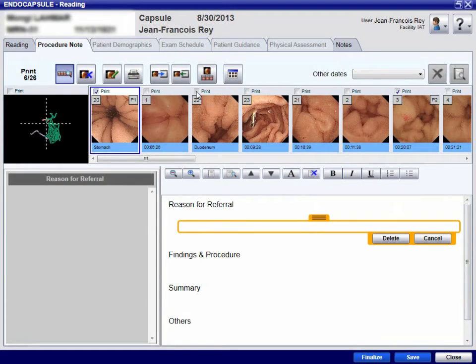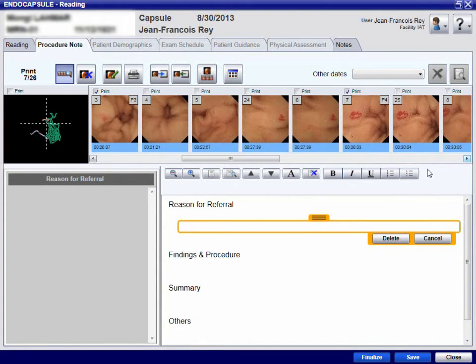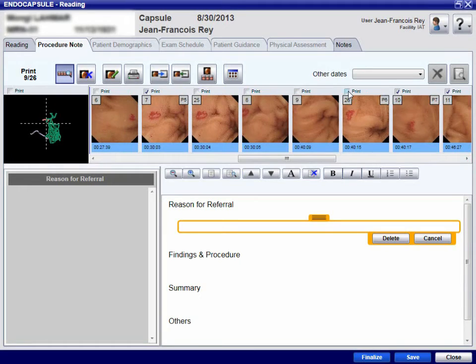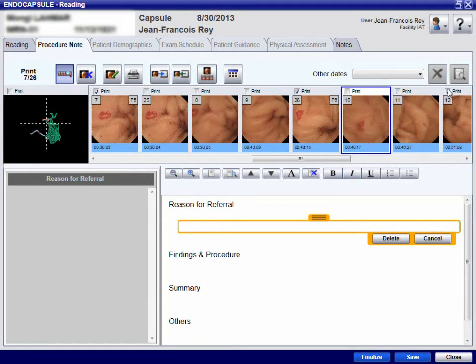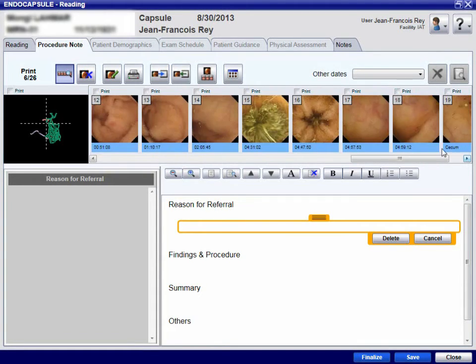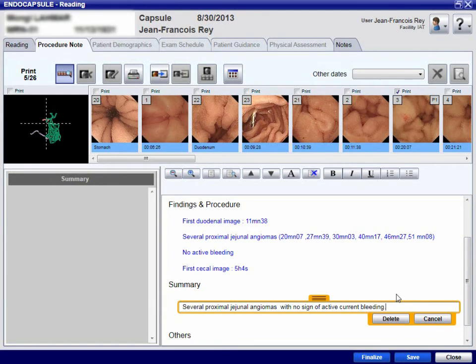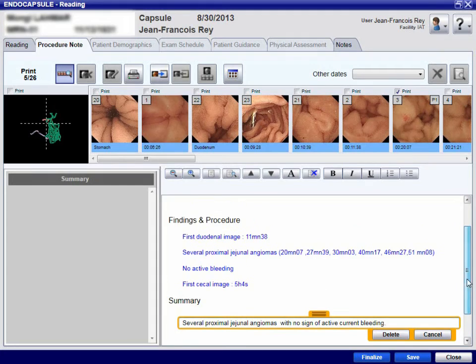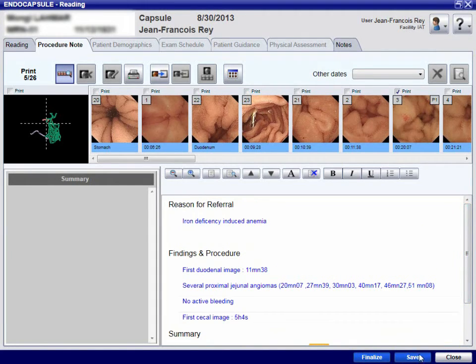In order to illustrate the report, images of various landmarks and small bowel abnormalities are selected and labelled. Findings and procedures are recorded in the report on the patient sheet, together with the final summary and physician identification and signature. Medical terms stored in the software can be used to write the report.